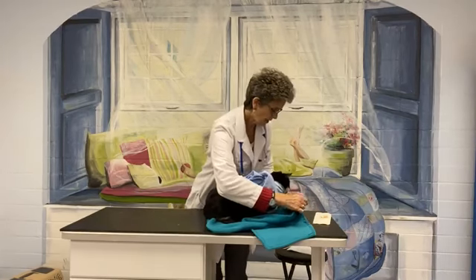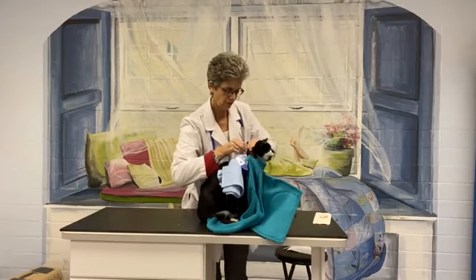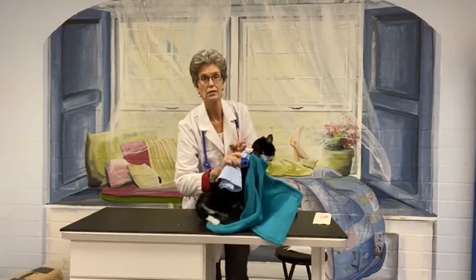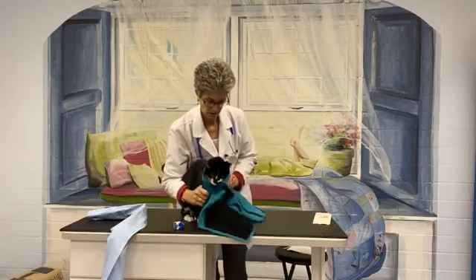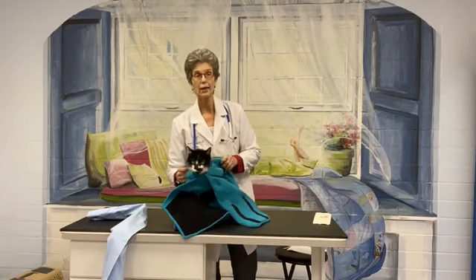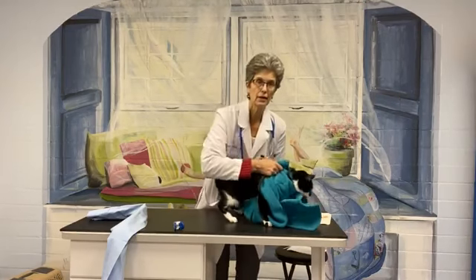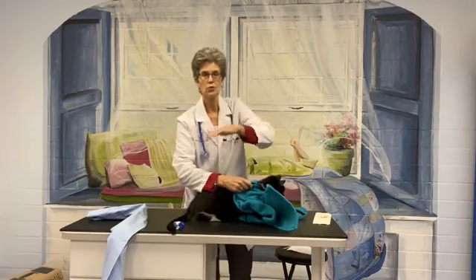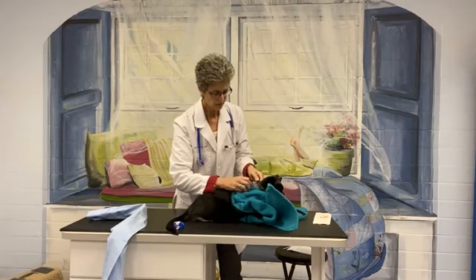So now to get the wrap on, we're going to come up and around his head, and you can get this right in front of the cowl. You saw that I got that in front of the cowl, so I'm imagining he's a cat who might be difficult to handle. And now I'm going to take the cowl off because I don't need it. There we go. Again, with this tool, this cat wrap, take either side to hold him like so as you position his body. This is what will help prevent him from swatting with his arms or wiggling around in it too much. We want the wrap to come up around him somewhat quickly.